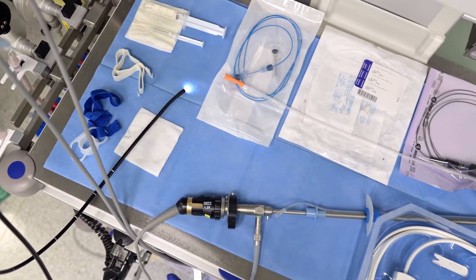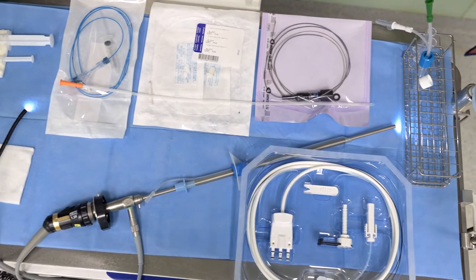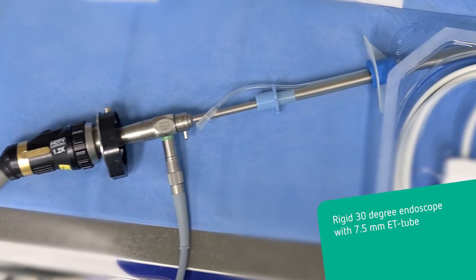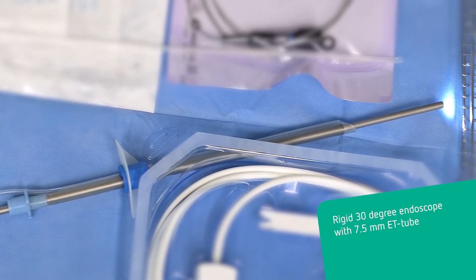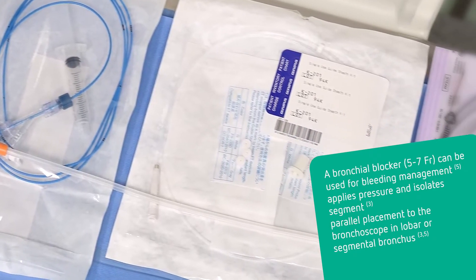In preparation for a cryobiopsy using flexible intubation, the following tools are prepared. The team at Torax Clinic Heidelbach is using a rigid 30-degree scope to facilitate intubation. The ET tube has an inner diameter of 7.5 mm and a separate channel through which the 6 French-gauge endobronchial blocker is inserted.